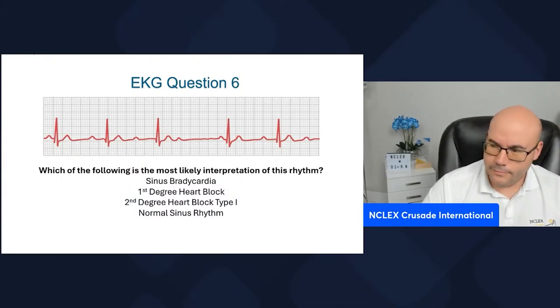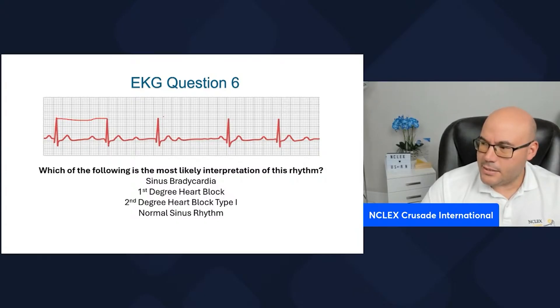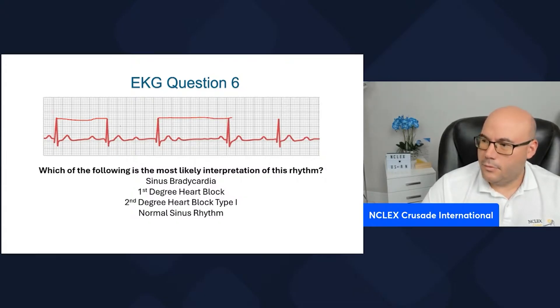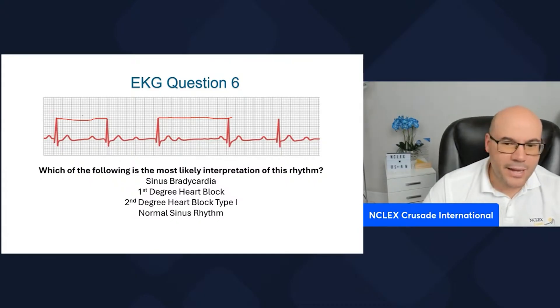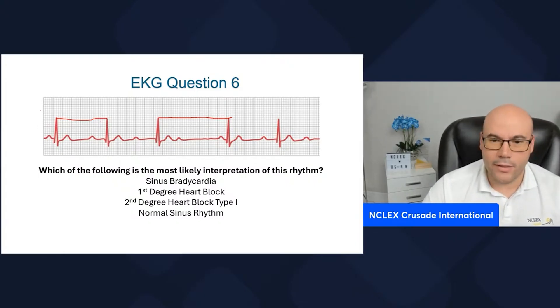Is this a regular rhythm? No, not a regular rhythm. Look at the distance from here to here — it's not the same distance from here to here. It's longer here: we have one, two, three, four, five, six, seven, almost eight big squares. Here we have one, two, three, four, five and a little bit. So this is not a regular rhythm.